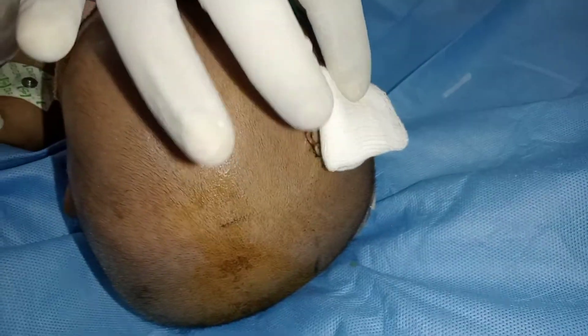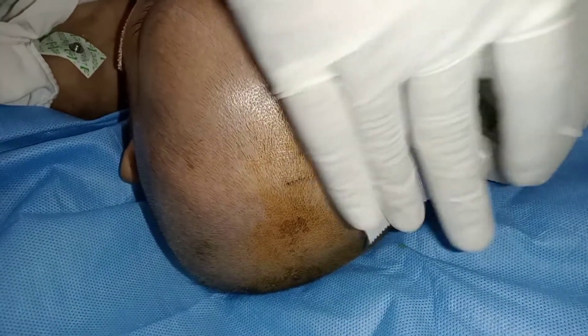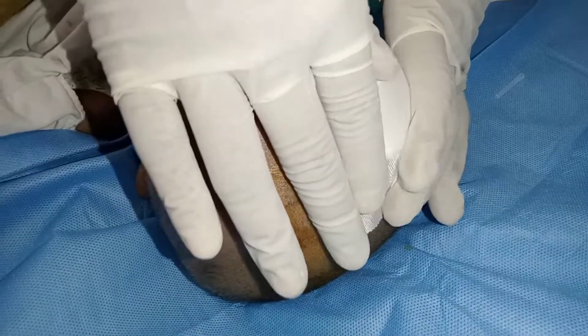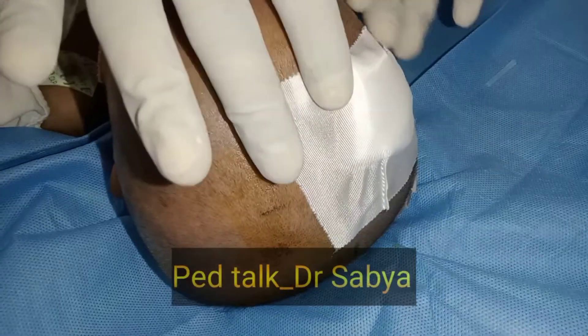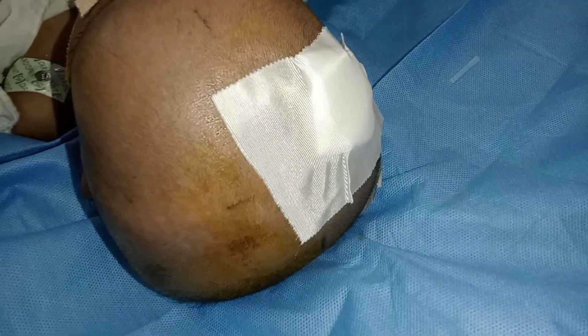For dressing purposes, the gauze piece is well covered with leukoplast, ensuring the seal all around.